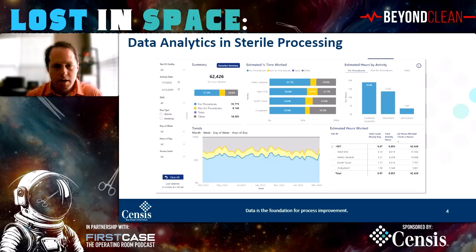Modern tracking systems enable you to track defects associated with trays. If a tray is sent up to the OR, the nurse finds, let's say, that there's no indicator in the tray, they can report that. That can be tracked as a defect. You can take that information and figure out who assembled this tray and therefore who's responsible, and so on and so forth. When we started looking at, in aggregate, the defect rates for trays, for technicians, for facilities, one of the things we found is that it didn't correlate with productivity in the way we thought.